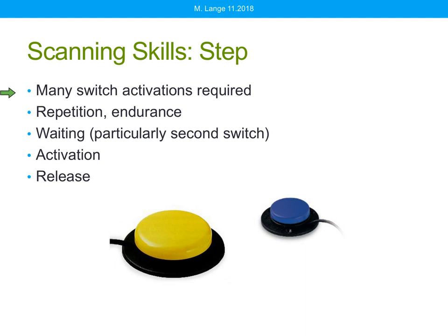With step scanning, there are more switch activations that are required. That requires a lot of repetitive movement and endurance on the part of the client. Some clients are going to be able to do this, particularly with practice and time. Others may have difficulty with this task. The client still has some degree of waiting that's required. It's not time to hit the second switch until I've moved through my desired vocabulary and I'm highlighting my desired selection.